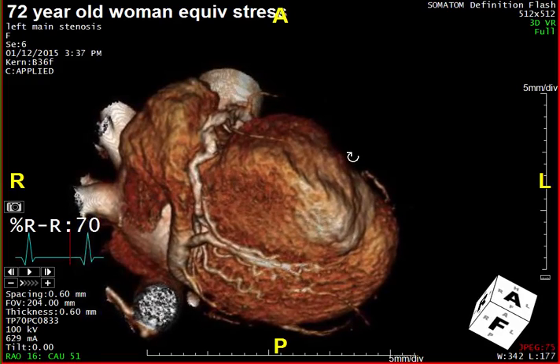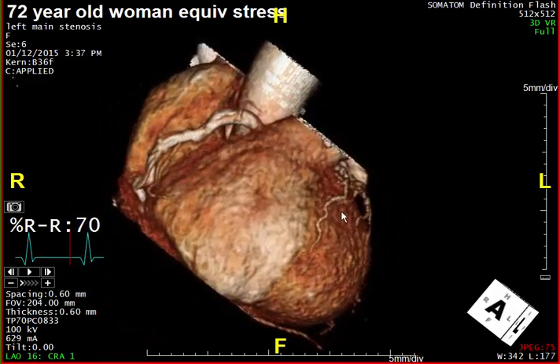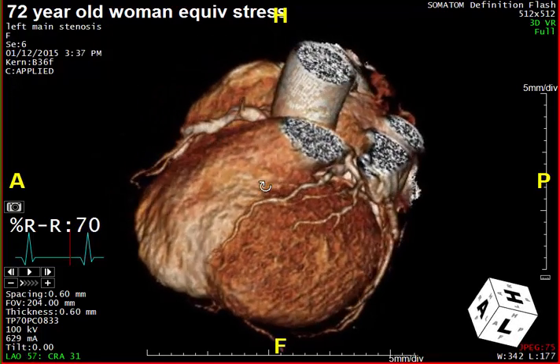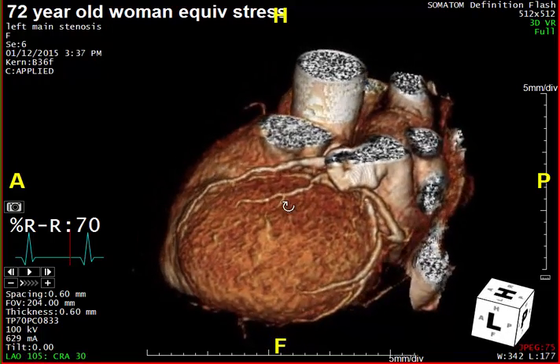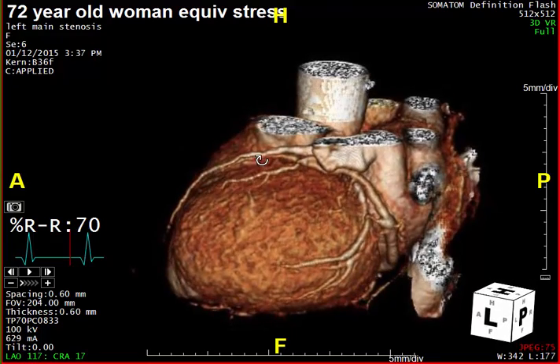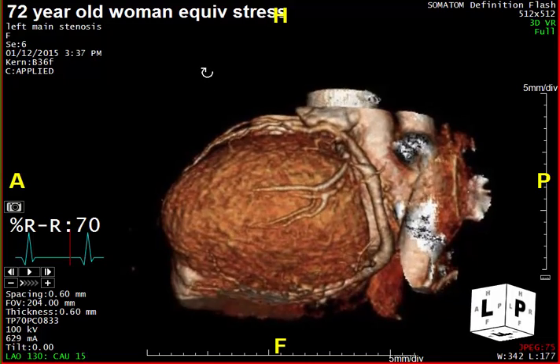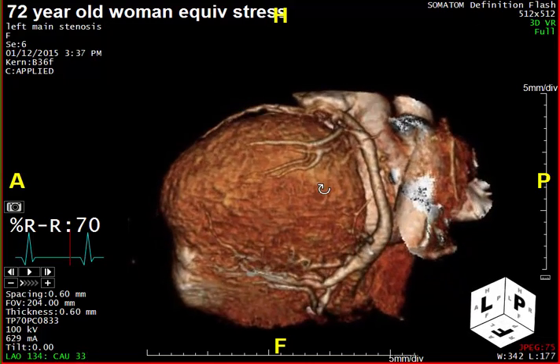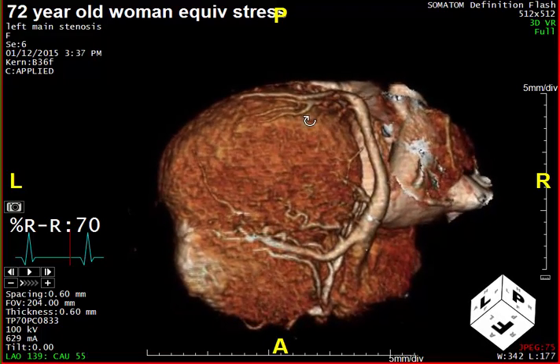This patient had an equivocal stress test. Shown here are three-dimensional renderings using a volume rendering algorithm. Looking overall at the coronary arteries, you can see that they're all patent. Unfortunately, when you look at 3D, you really don't get an idea about the details of the coronary arteries themselves in terms of pathology. But we can clearly see that everything is patent.